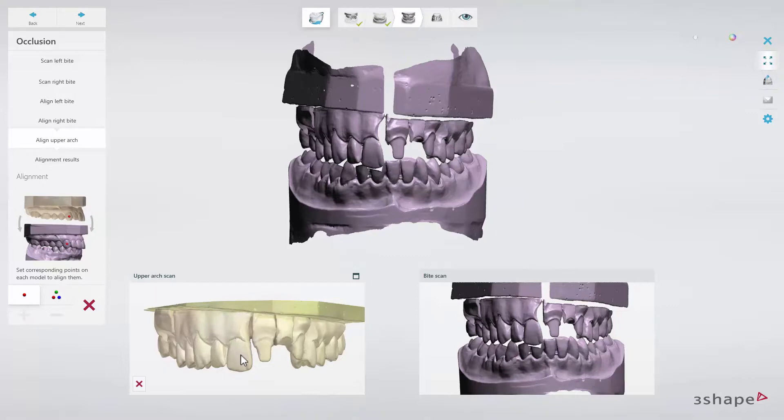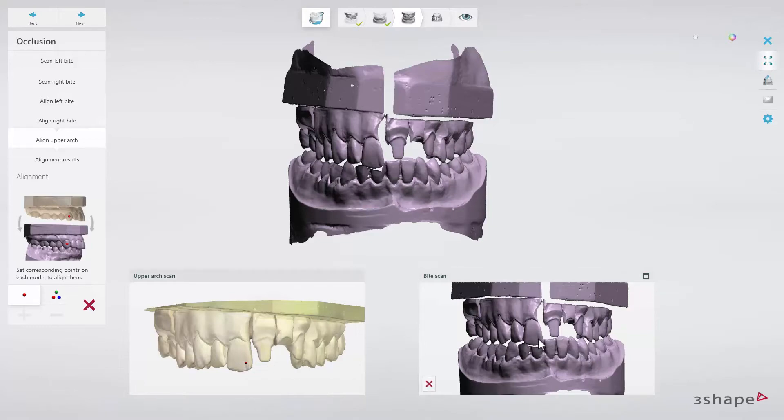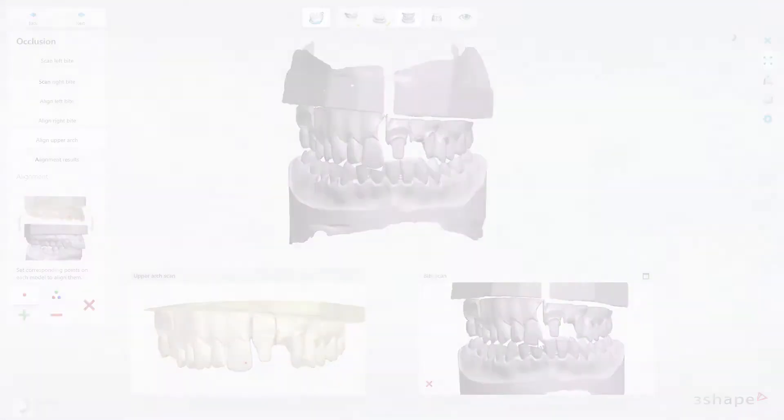Then you must align the upper arch. Aligning the upper arch is the same as the previous one. You need to set the corresponding points on the scans again.